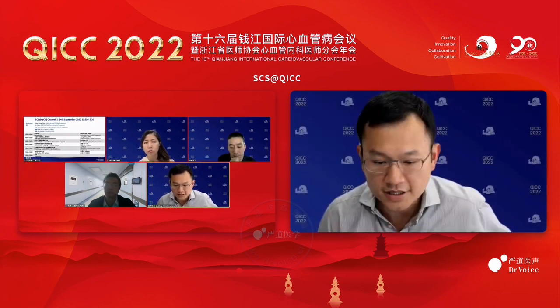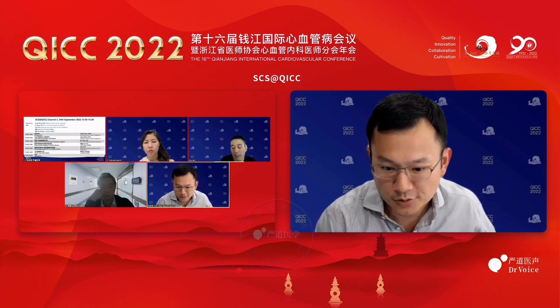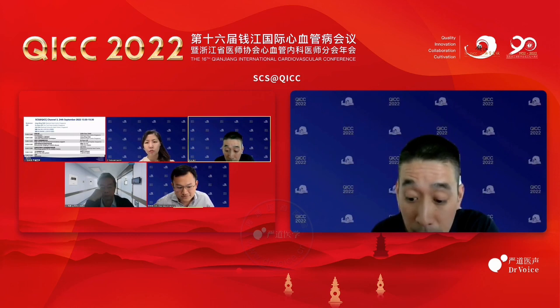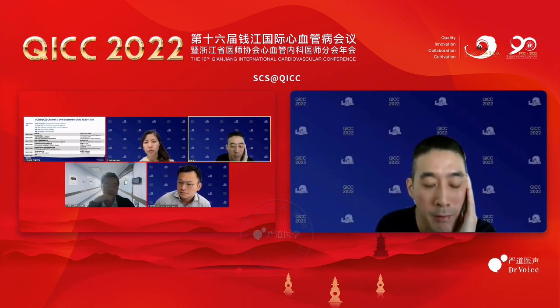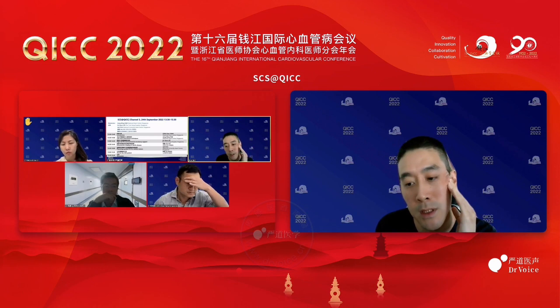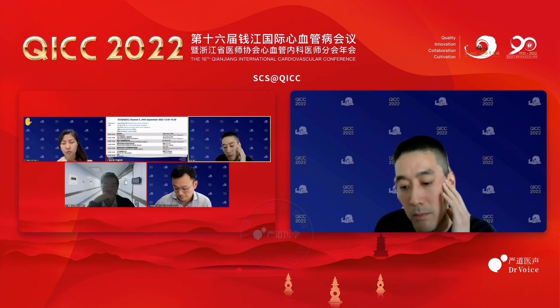So you're saying you don't look at the value of FFR or IFR, but rather you look at the pressure drop as you pull back the wire. Oh, you mean post-PCI, what value I'll be happy with? Yeah, let's say you have tandem lesions and you've fixed one, and then you want to decide whether or not to fix the other. What value would you accept? Yeah, and then actually I will still go by that. If I don't find any gradients, I mean, we do know that your FFR and RFR post-PCI, the higher the better, but in certain cases where you have diffuse disease, you're never going to reach a normal value or a high enough value. So if I don't find any jump, I'll just stop.